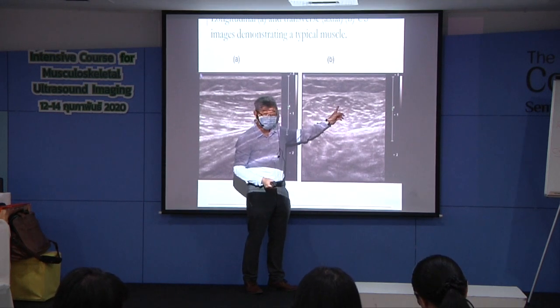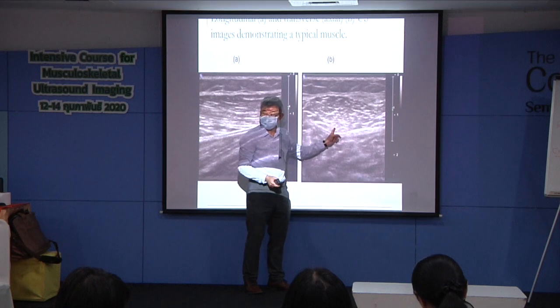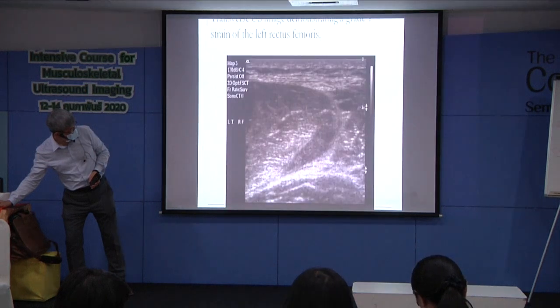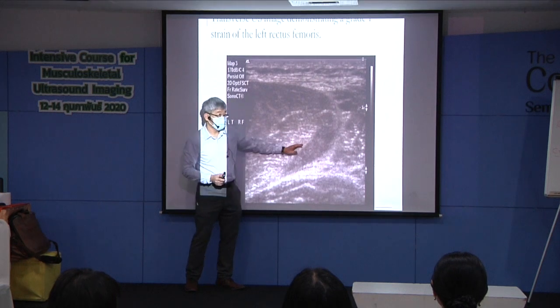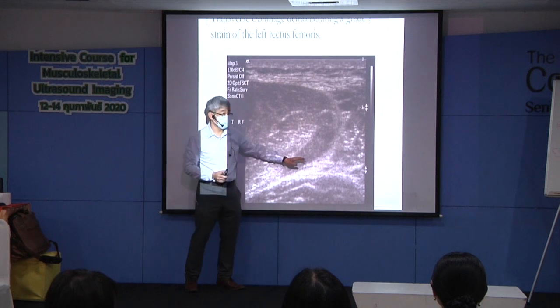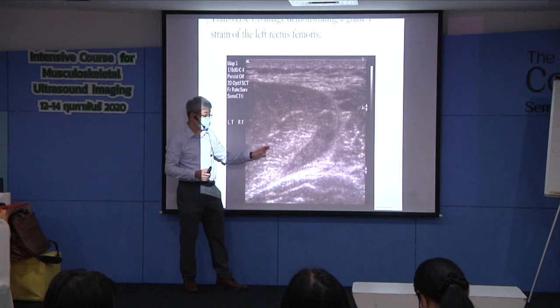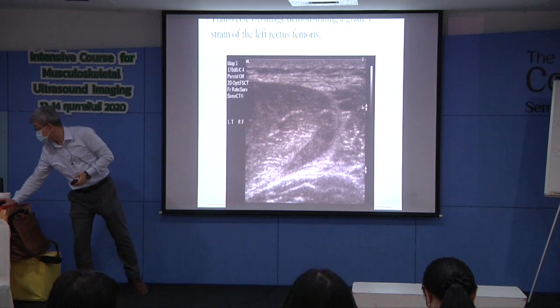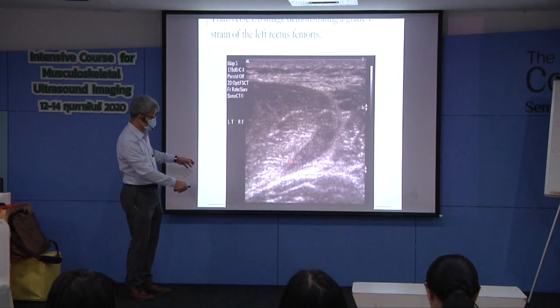Especially the hypoechoic area with discontinued fascicle. The fiber here is still okay. The fiber around this area is swelling or ruptured. So you can use the area percentage to predict the functional loss. And this is grade 1 injury.